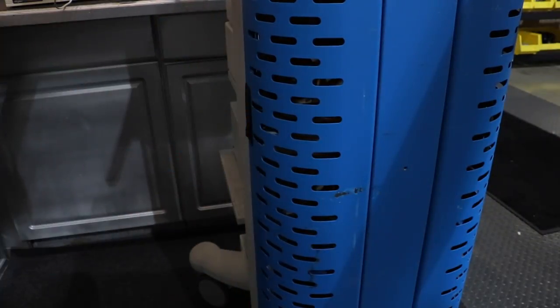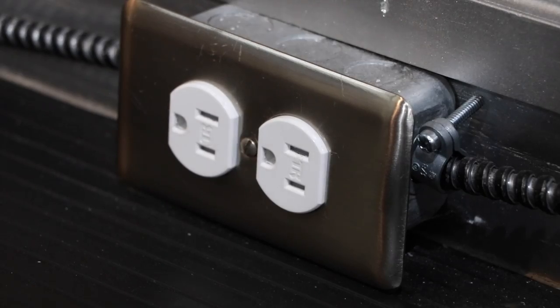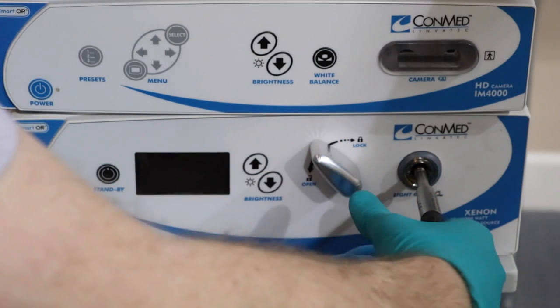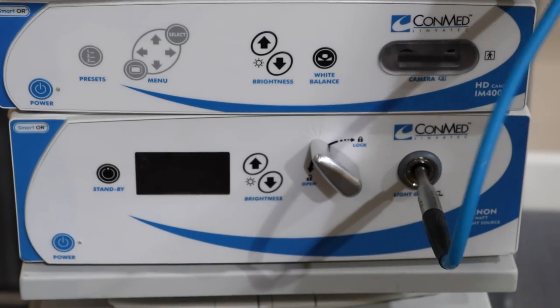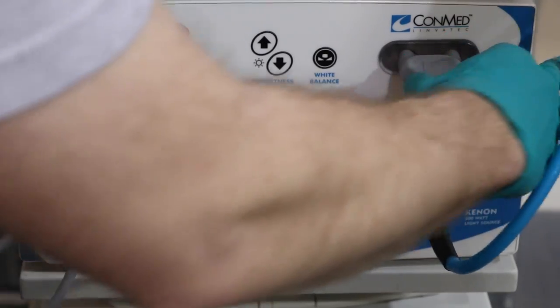Let's close up the tower. We'll go ahead and take our cart's power cable and plug it in. Grab our fiber optic cable and plug it into the front of the LS7700, and take our camera and plug it into the front of the IM4000.